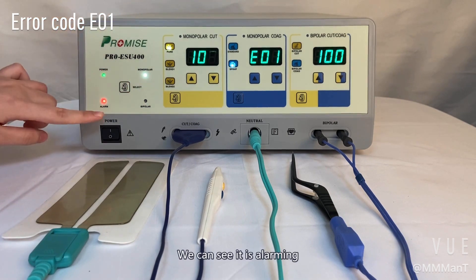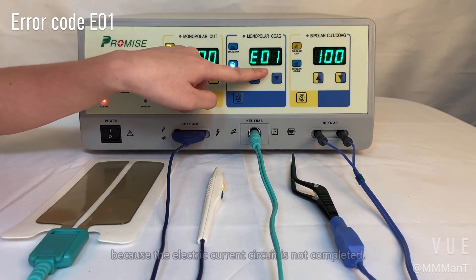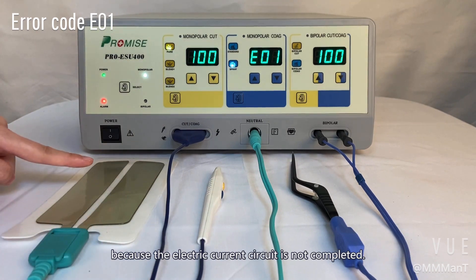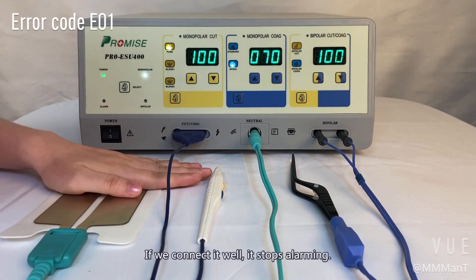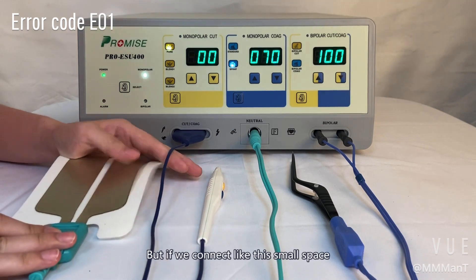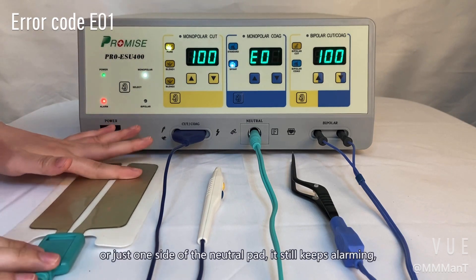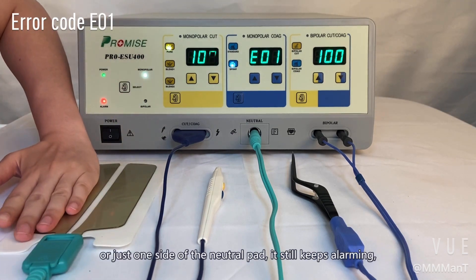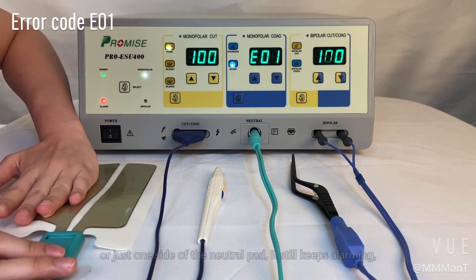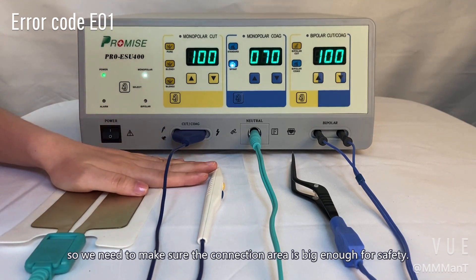We can see it is alarming and showing error code E01 on the display, because the electric current circuit is not completed. If we connect it well, it stops alarming. But if we connect like this — with a small contact area or just one side of the neutral pad — it still keeps alarming. So we need to make sure the connection area is big enough for safety.